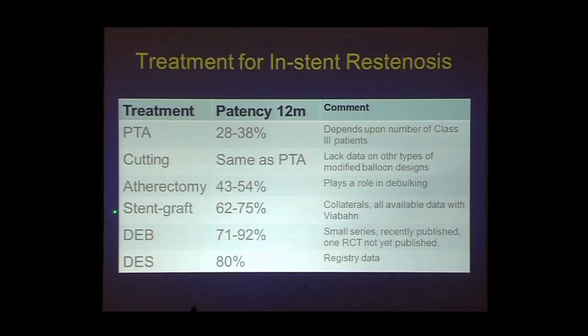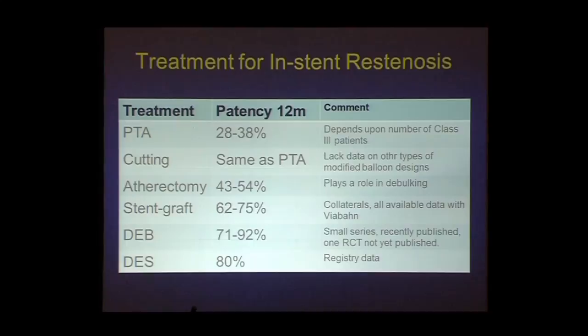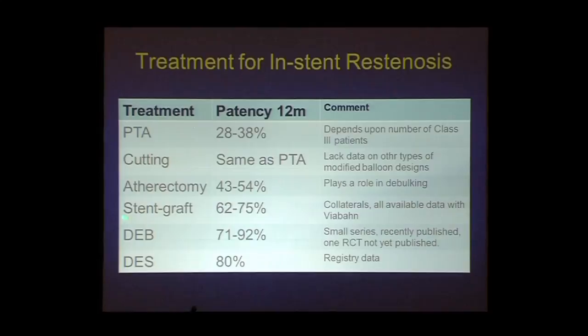The stent graft claims are pretty substantial, and the claim is that we are now getting to a slightly higher level of improvement. My worries about the stent grafts are things like collaterals. In perhaps the garden variety population of first-time treated patients, if you cover a few collaterals, you may not really find that high-risk group that got into trouble because their collaterals were covered. And yet, in this case, these people have already failed therapy once. Their leg has survived because of collaterals, typically. And so with a treatment that covers collaterals, I think you just have to be super careful. All the available data is with Viabahn, so that's the other thing to know.